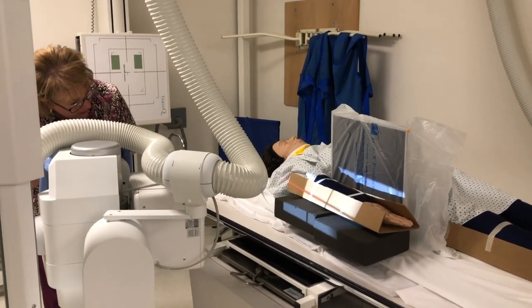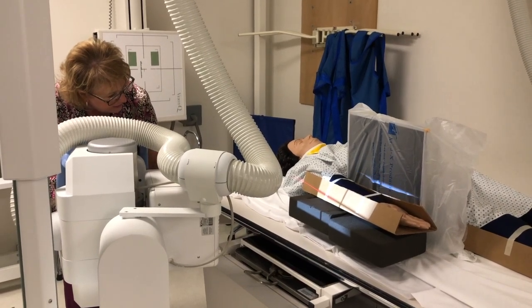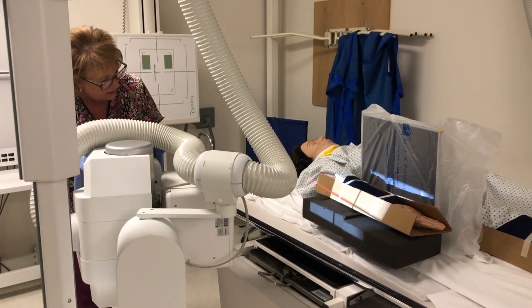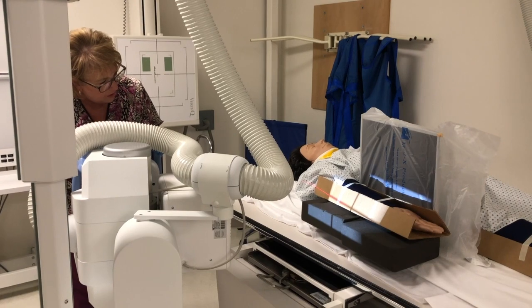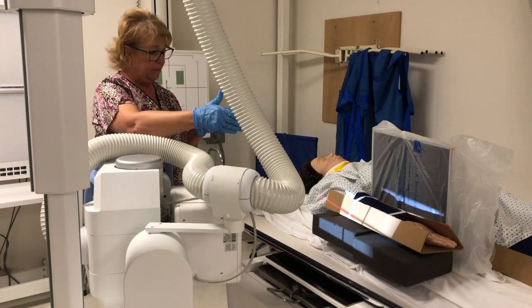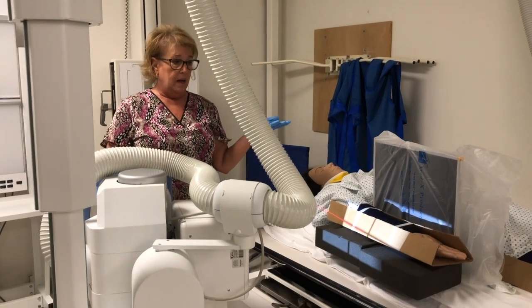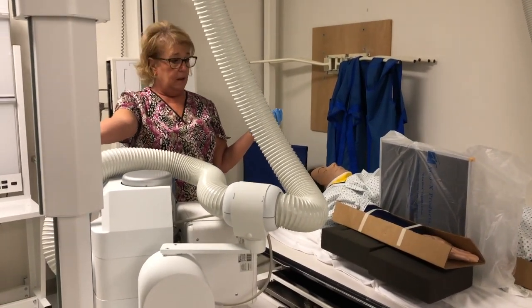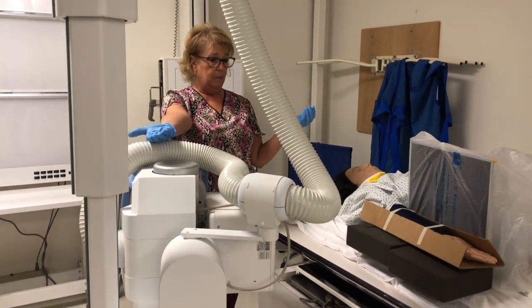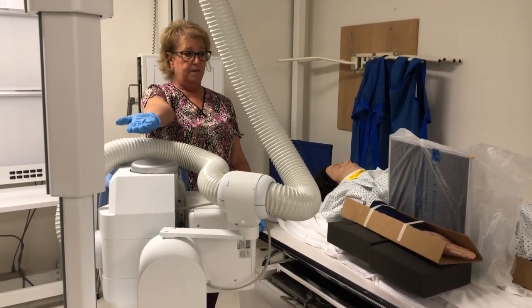All right, so I'm at max SID here, and it looks like I'm past her wrist and her elbow. So if I wasn't, I'd have to take a second shot to include above the elbow, but I think I've got it here. Now this isn't normal lateral forearm. The patient's in an AP position, but their arm is rotated completely anatomical position. So from a horizontal beam, this should be the equivalent of a lateral forearm.